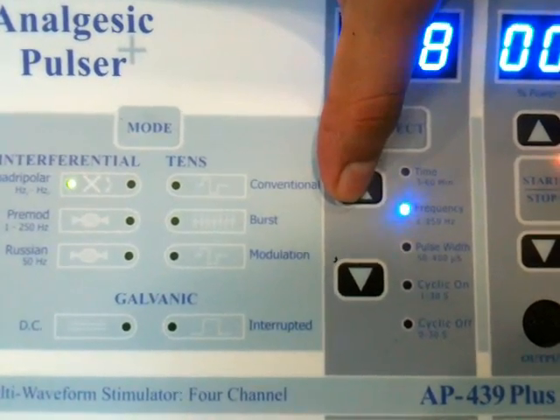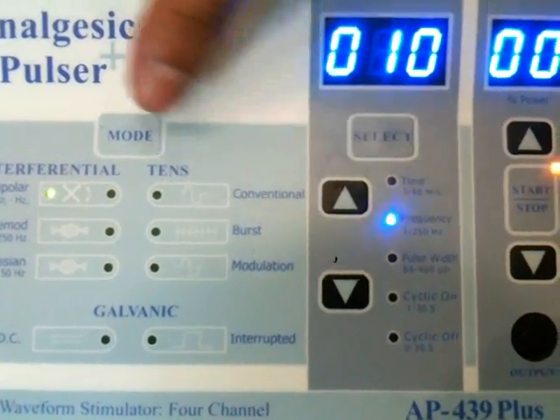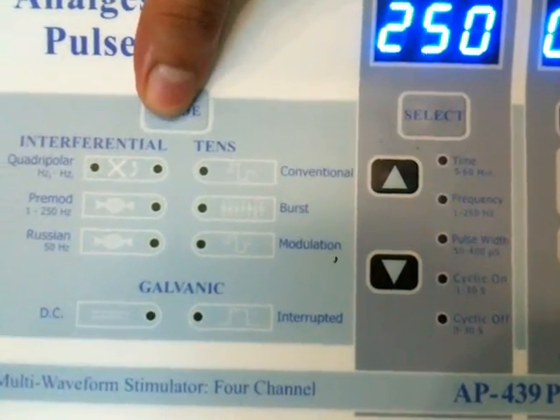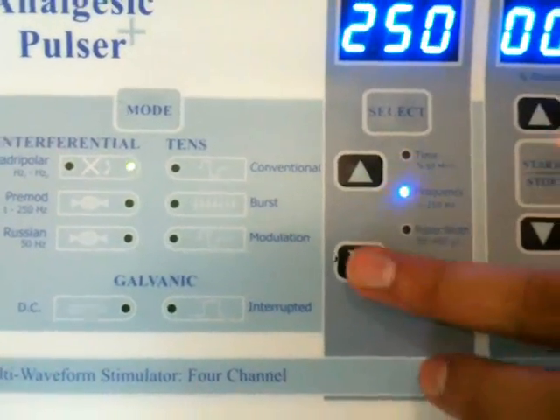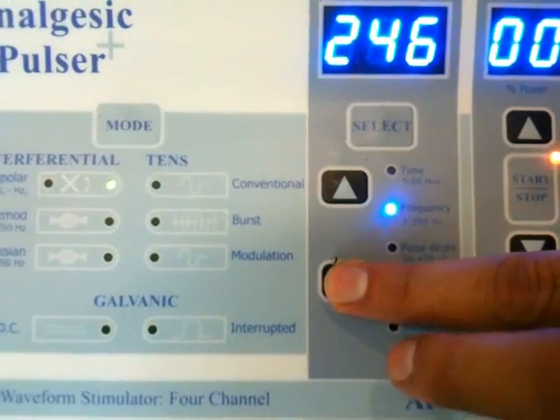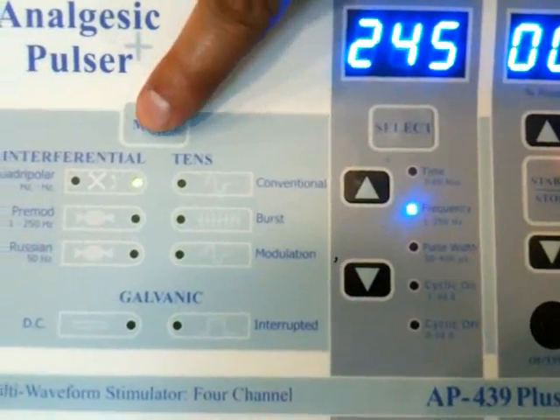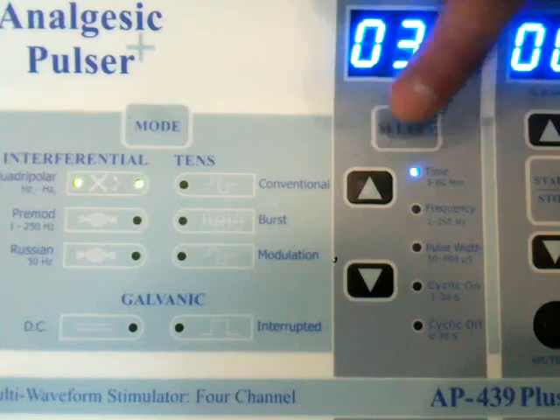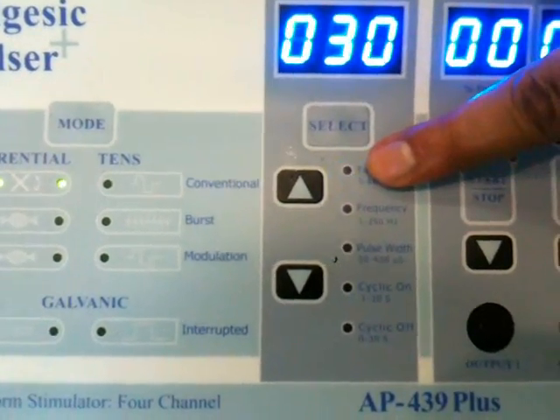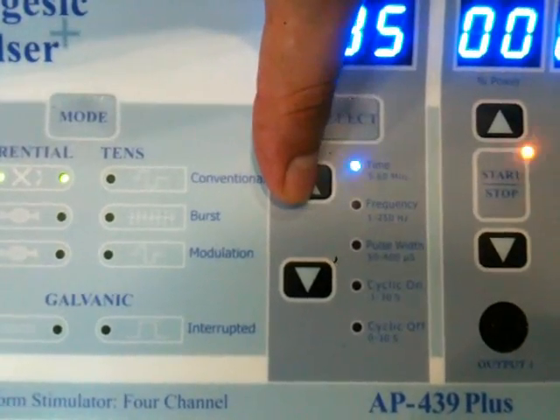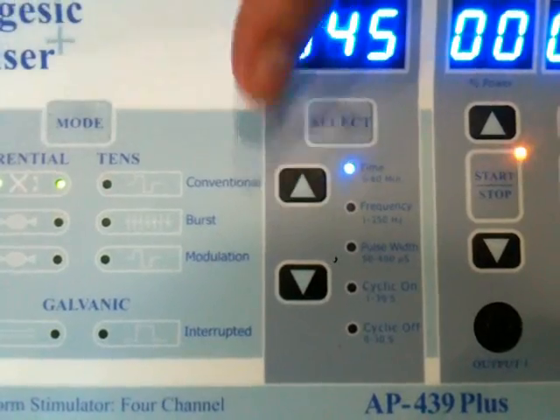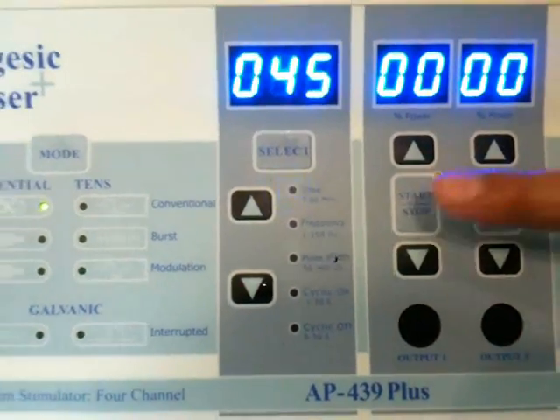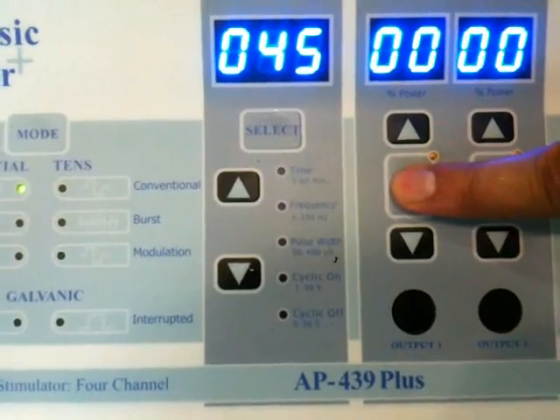Here we can change the frequency. If you want to switch to another mode, by pressing the mode key. Here is the timer. To save this setting, press the start key again.